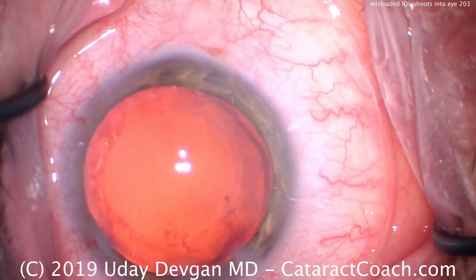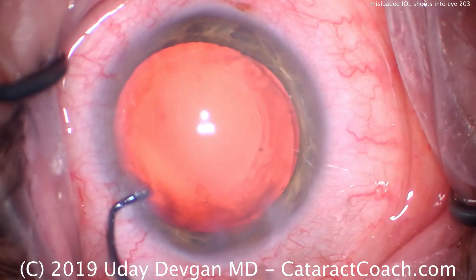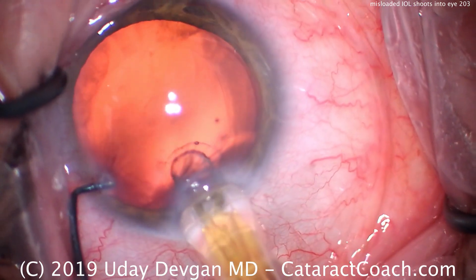It's CataractCoach.com. We have the cataract removed from the side. The capture bag is filled with viscoelastic, ready for the new IOL to go in. Watch carefully. Delivering the lens.